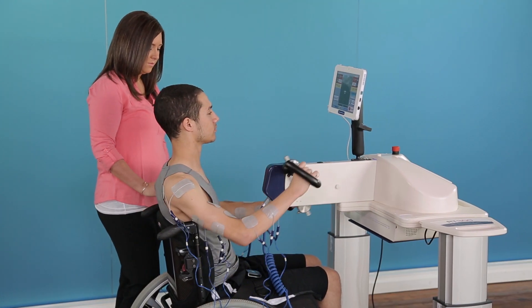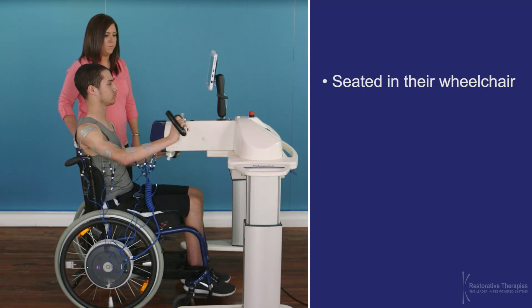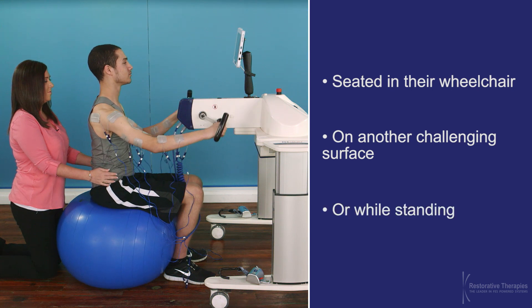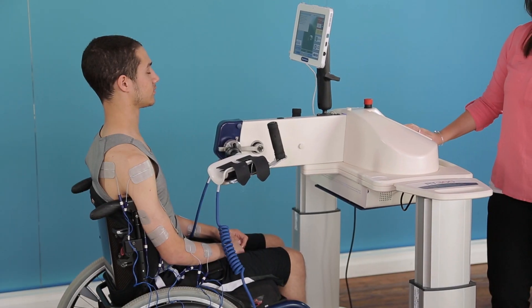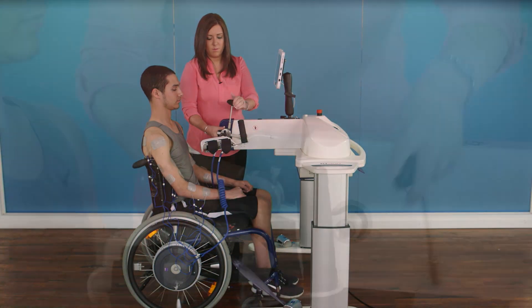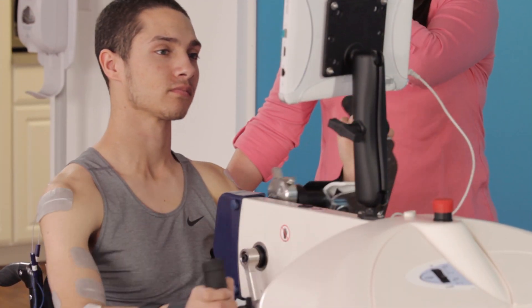This RT300 can be used as an FES arm cycle with the patient seated in their wheelchair, on another challenging surface, or while standing. The RT300's height can be easily adjusted, as can the arm pedal crank radius, so that the rider can be ergonomically positioned with optimal range of motion.